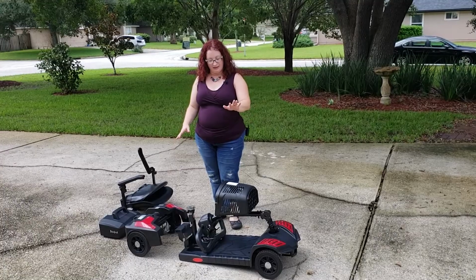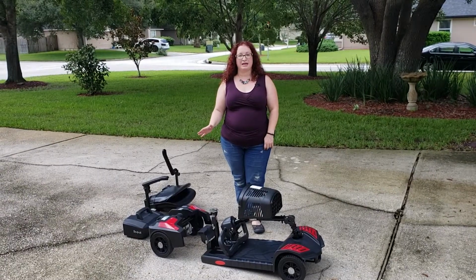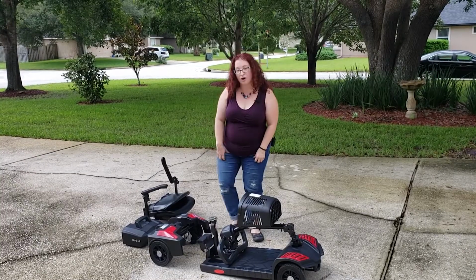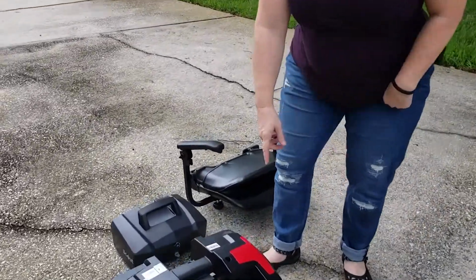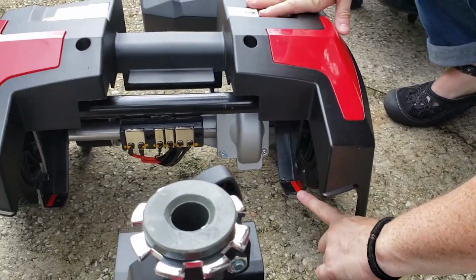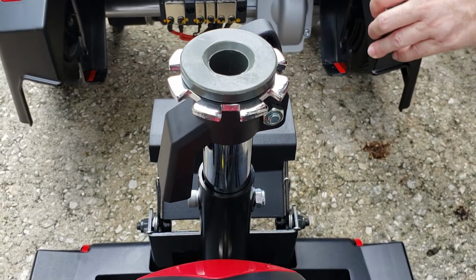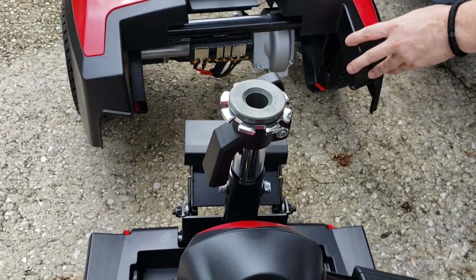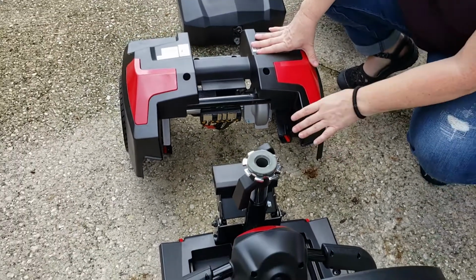So the first thing we'll do is reassemble the front section and the rear section. And this is a pretty important part because you want to make sure that everything comes together. It should come together very easily, and there are guide marks to help you know how to put it back together. So you can see that there's some red tape inside here and on the other side as well, and it lines up with this red tape here. So it does make a difference if the parts are in alignment with each other, like if this is crooked or not totally straight, you might have some trouble getting it back together.